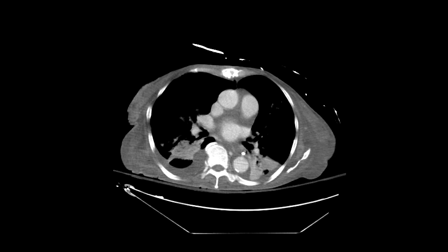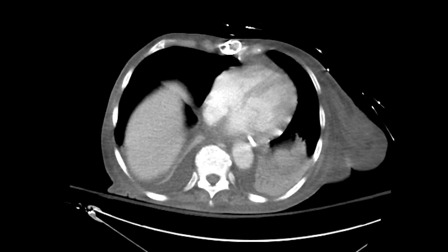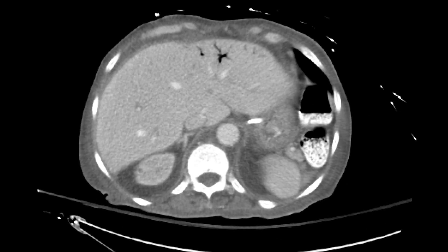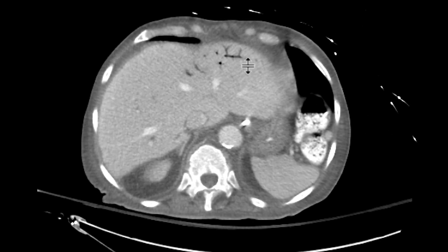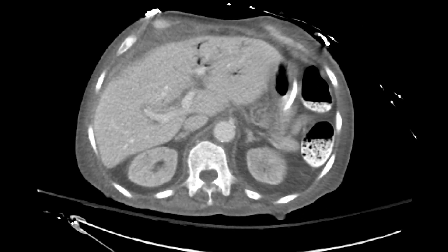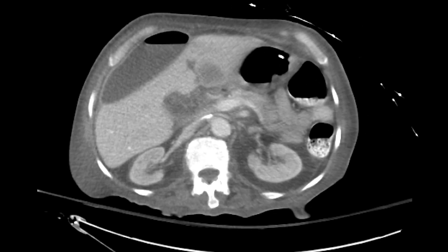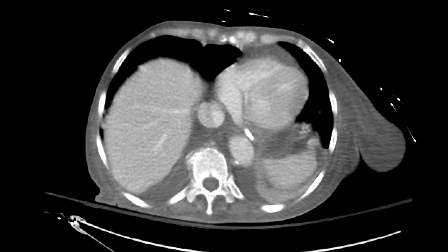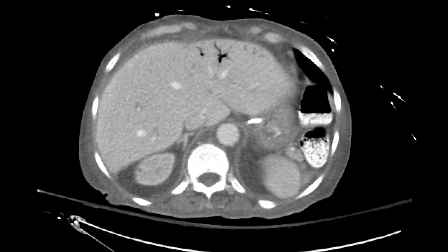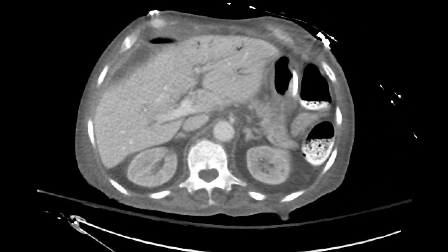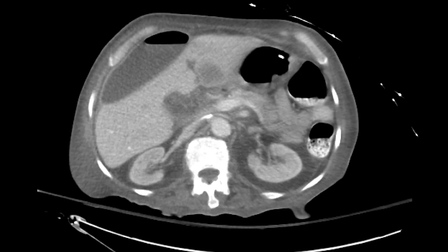This is a challenging case of a patient who presents with abdominal pain. As you scroll down, the first thing we'll notice is that there is some portal venous gas in the left hepatic lobe, which suggests that there is ischemia somewhere in the bowel. We'll have a look for that a little bit further down.